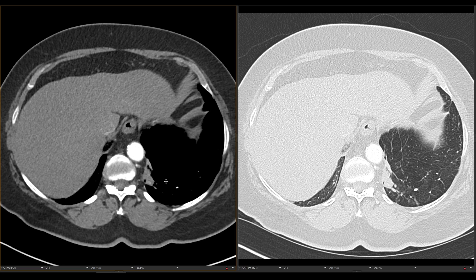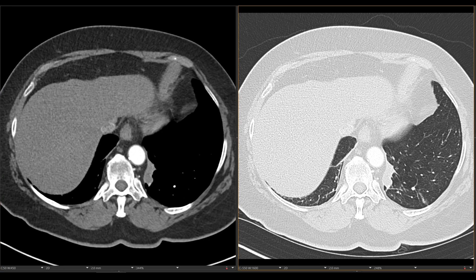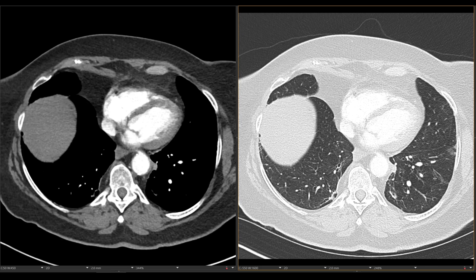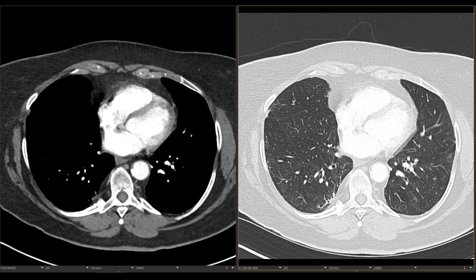There are two types of sequestrations: intralobar and extralobar. Intralobar sequestrations are part of the normal lobe — encompassed within the left lower lobe or right lower lobe usually. Whereas an extralobar sequestration is like its own little lobe — it has its own separate pleura. In this case, you can see that this sequestration, this abnormal lung, does not have its own pleura. It's part of the rest of the left lower lobe, so this is an intralobar sequestration.